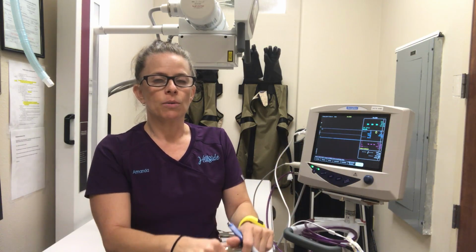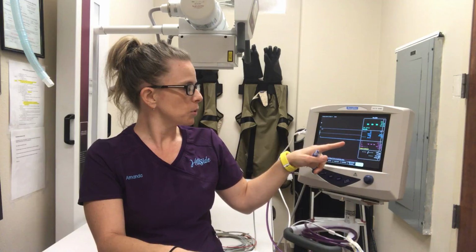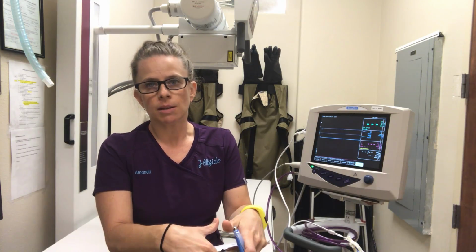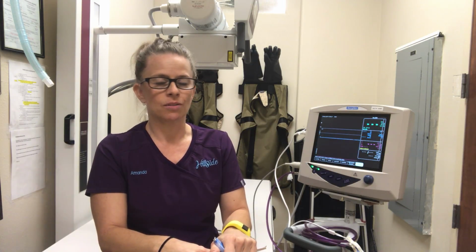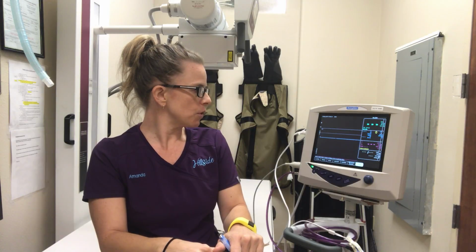So you can follow that and monitor that, make sure that seems normal. With checking the respiratory rate, not only are you monitoring here, but you're physically looking at your patient, watching the rise and fall. You want them taking nice deep breaths. During certain stages of anesthesia, they might be panting or hyperventilating, so you want to watch out for that.